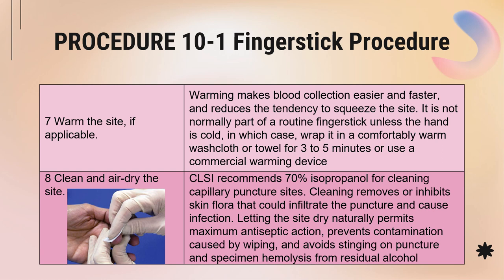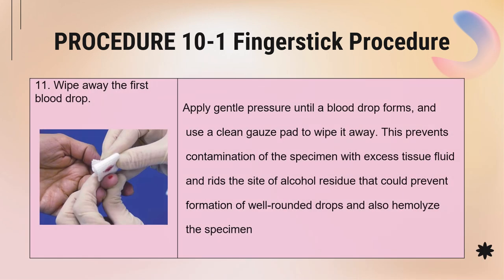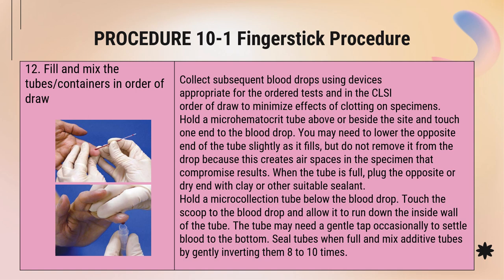Or if you don't have a warming device, you use a washcloth soaked in warm water. So 8, clean and air dry the site. So 9, prepare the equipment. 10, puncture the site and discard the lancet or the incision device properly. Then grasp the patient's finger with your non-dominant hand. 11, you should always wipe away the first blood drop. And then 12, fill and mix the tubes or the containers in the order of draw.